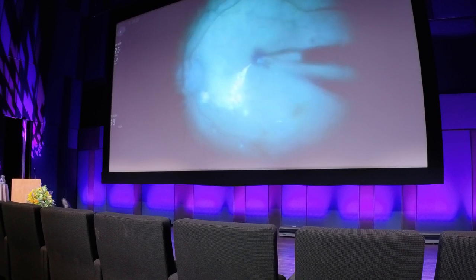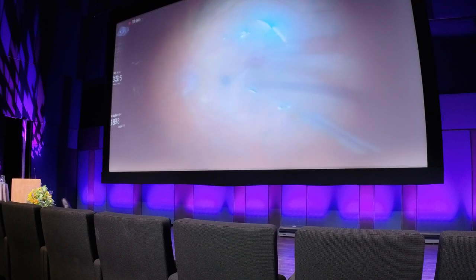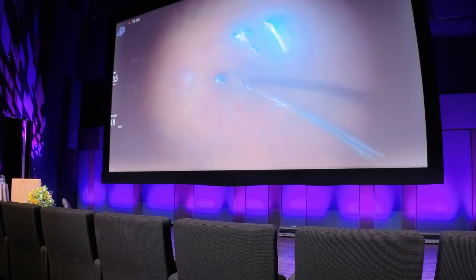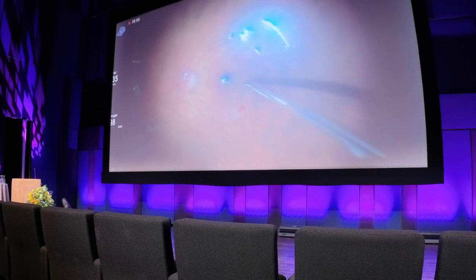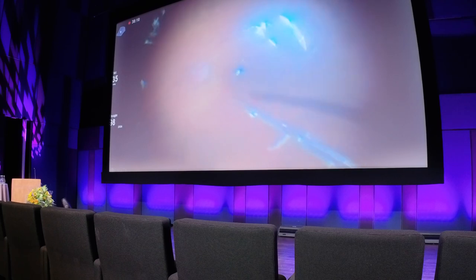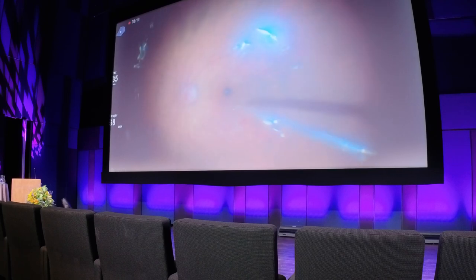I must say that this is an image through the biome — I don't use a contact lens. This is the fluid-air exchange. And that's it. Thank you for your attention.